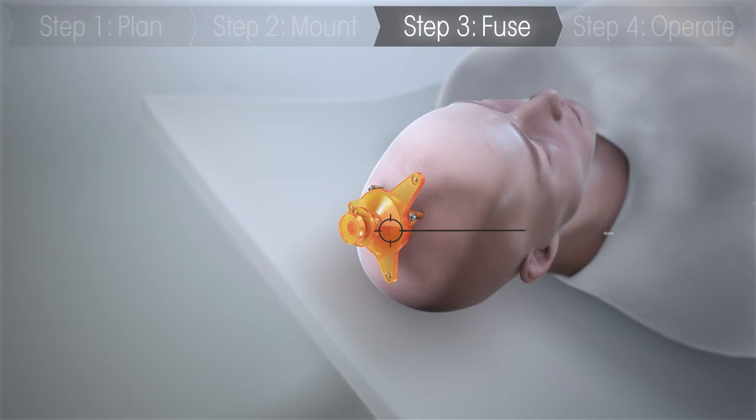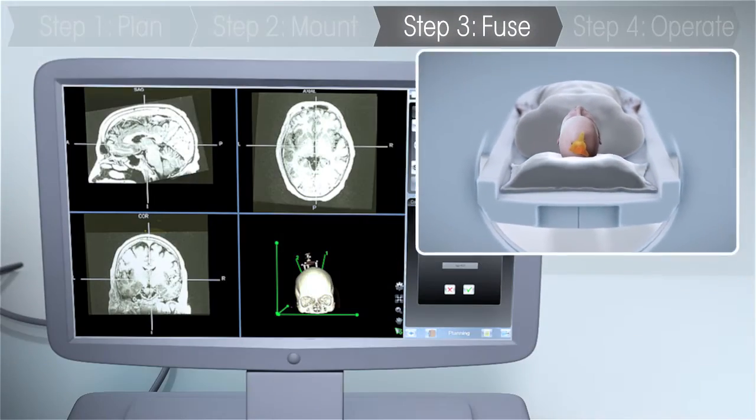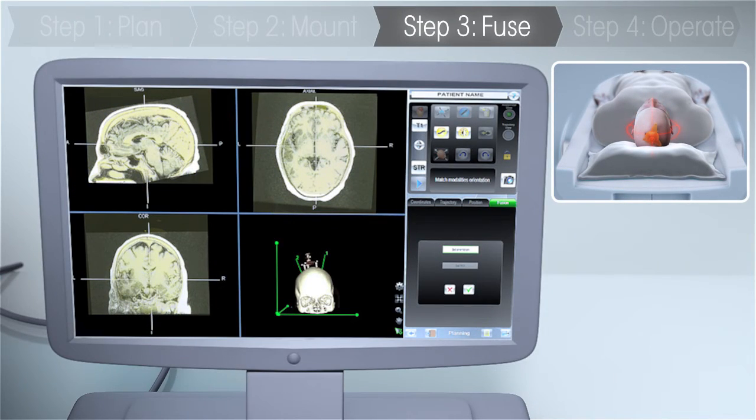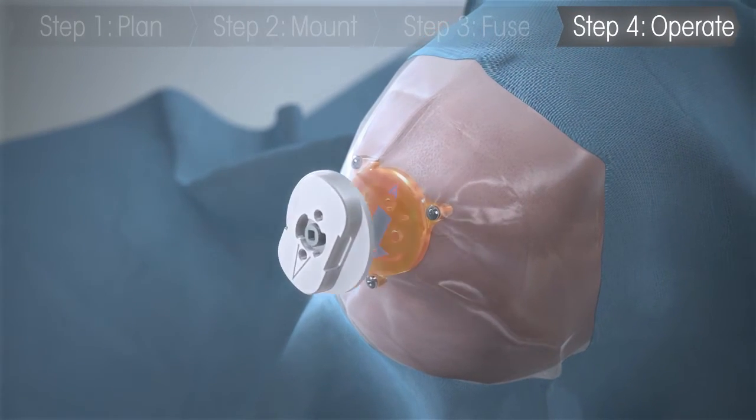The marker is attached to the platform and then a CT scan is taken. The CT scan is then fused with the preoperative MRI scan in order to execute the surgical plan that was created by the surgeon with Renaissance's software.